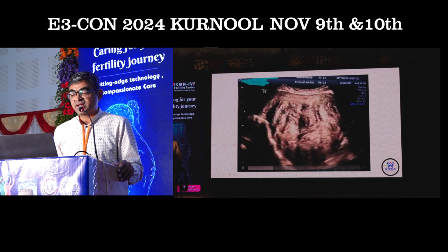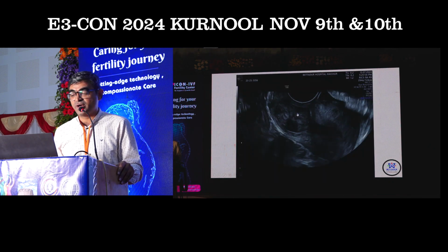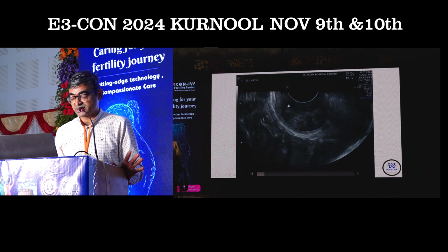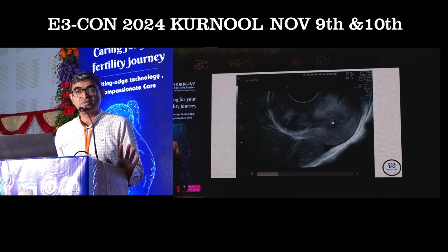Yet another case in cervical canal. In the cervical canal, you are able to appreciate a fibroid. But do you think it is actually a cervical fibroid? You are able to appreciate a black color like thing over here. The shadows are black here. That is to tell me likely this fibroid is coming from the corpus. It is not from the cervix.